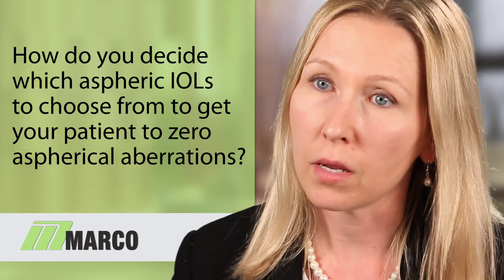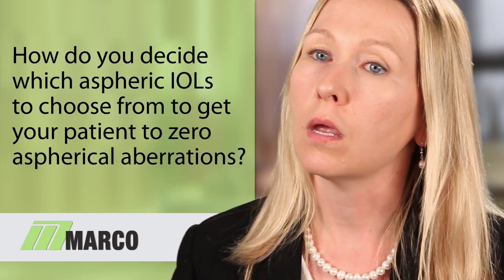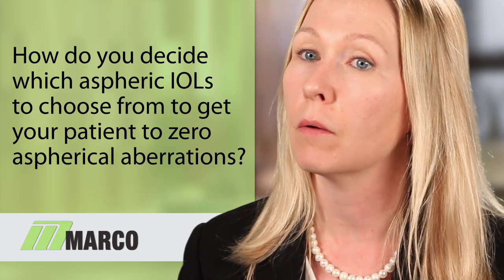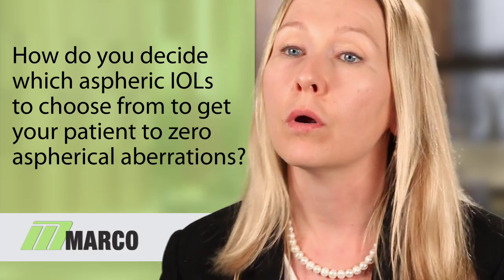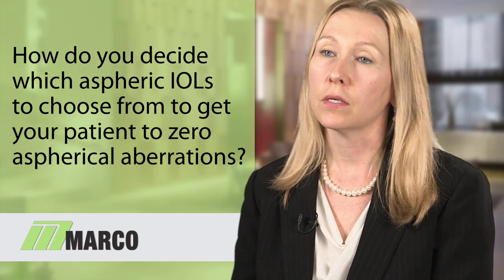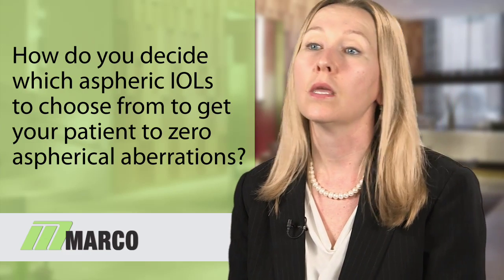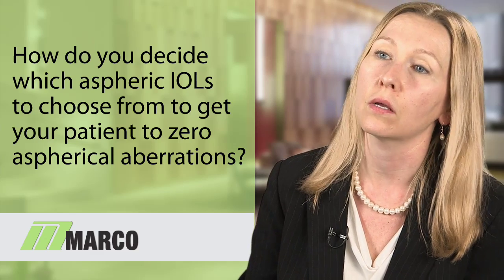We went to the OPD and realized that she has been implanted with a negative spherical aberration lens of the highest power, and her negative spherical aberrations were extremely high. They were over -0.6. This patient obviously had high negative spherical aberration before surgery, and then the implant added more negative asphericity to her cornea.